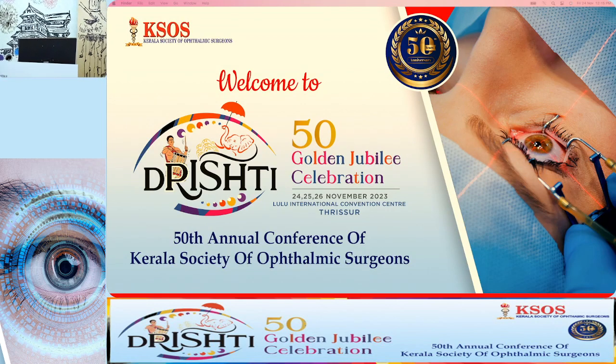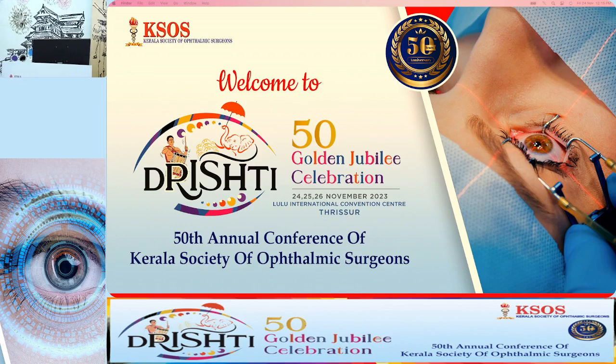To start a therapy for glaucoma, IOP readings 3 times a day is preferable. But the ideal would be diurnal IOP measurements. And if the IOP is more than 30 millimeters of mercury, reconfirm once again and start therapy. So as she said, Goldmann applanation tonometry is the gold standard. But the presence of raised IOP does not equate to the diagnosis of glaucoma. Conversely, decreased IOP or normal IOP does not exclude the diagnosis of glaucoma.